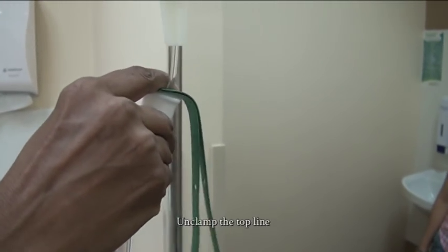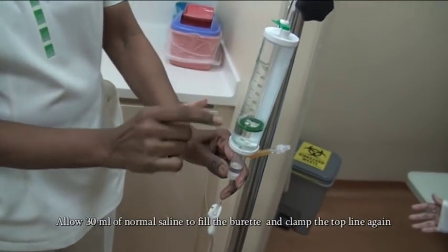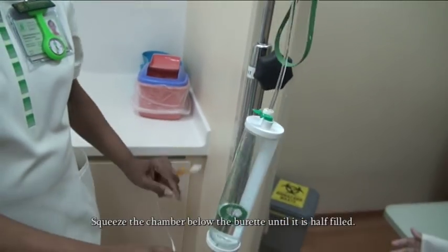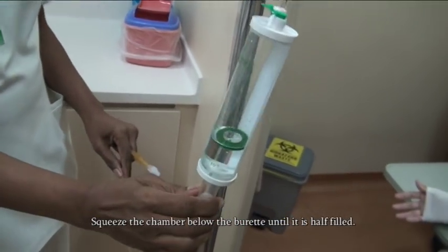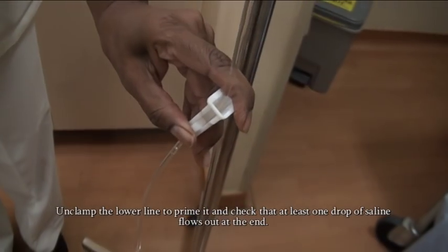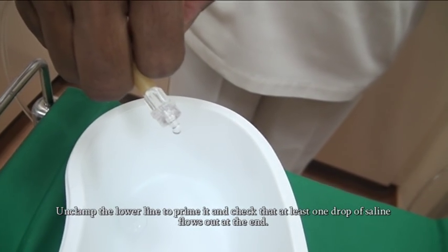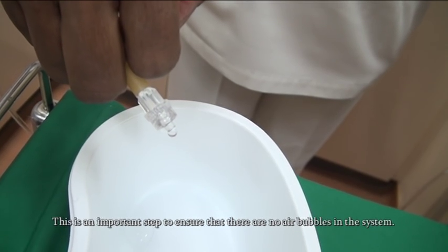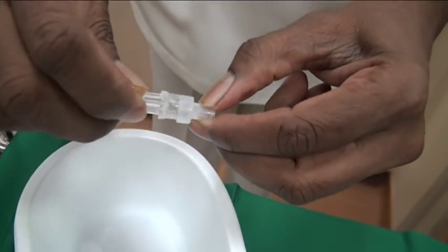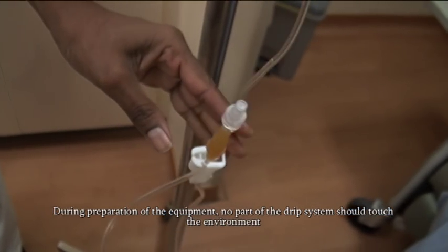Unclamp the top line and allow 30ml of normal saline to fill the burette, then clamp the top line again. Squeeze the chamber below the burette until it is half filled. Unclamp the lower line to prime it and check that at least one drop of normal saline flows out at the end. This is an important step to ensure there are no air bubbles in the system. During preparation, no part of the drip system should touch the environment.